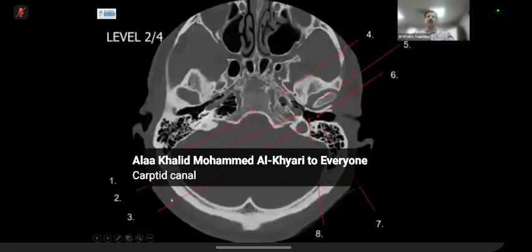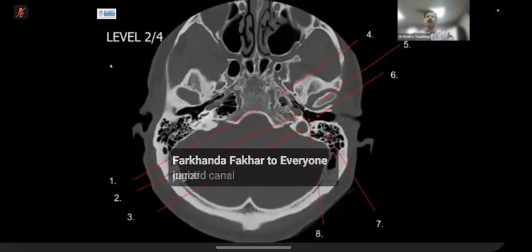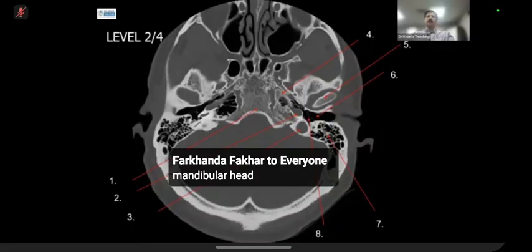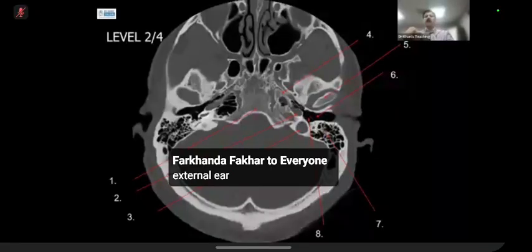Number 3. Excellent. Number 4. Number 5. Number 6. Number 7. Number 8. Okay, so there were a few different answers for number 8.